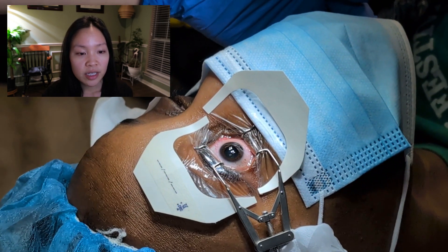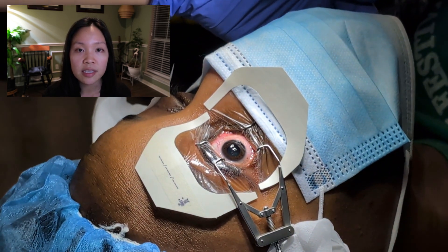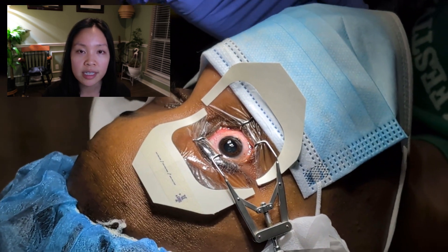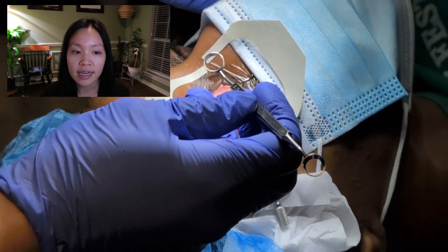The patient has a lid speculum that goes underneath her upper and lower eyelids and this will help to very gently keep those lids open so she doesn't need to worry about blinking, opening, or closing the eyes.